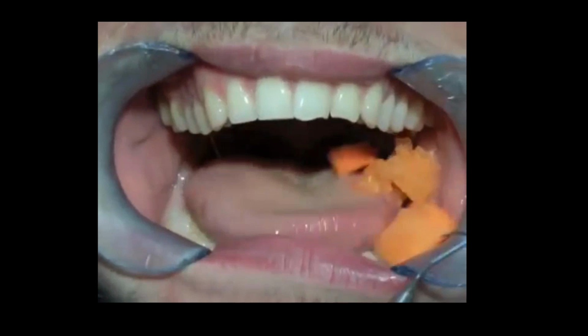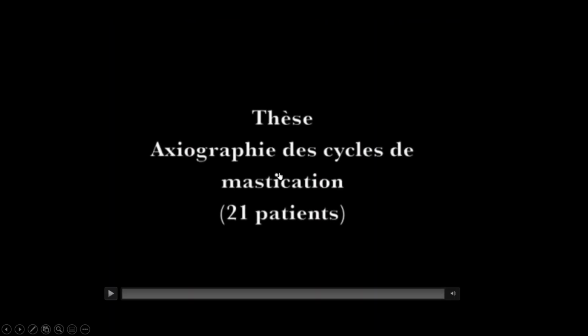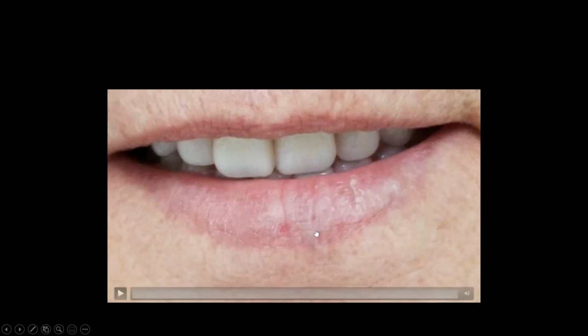How do I identify chew cycle in a wax try-in? Well, get your paper ready because I'm going to show you. Okay. All right. This is a patient. She's going to say, now on a wax try-in, we would say 66, 66, 66, Mississippi, Mississippi. And I would be looking at, do the teeth follow on the wet and dry line? Is the midline right? All of these things.